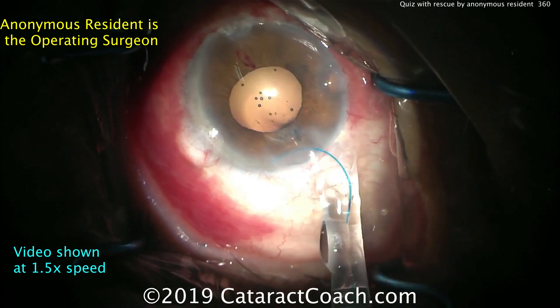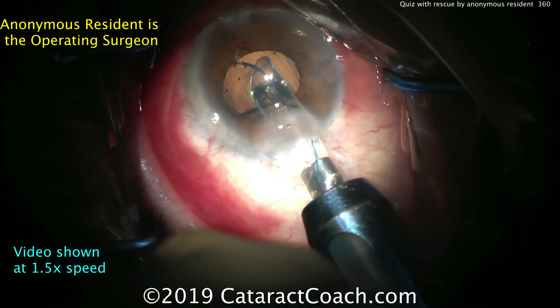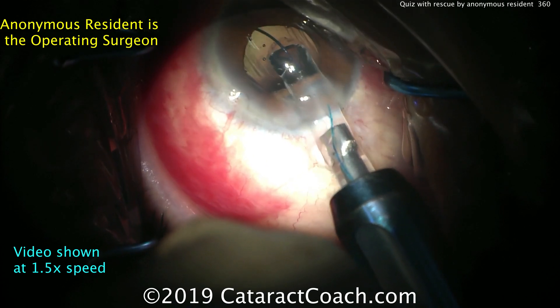Good — that's a good clue that it wasn't the right direction. So now getting it in, being careful not to damage the haptics. There you go, that first haptic goes in great. Now that's the correct orientation.